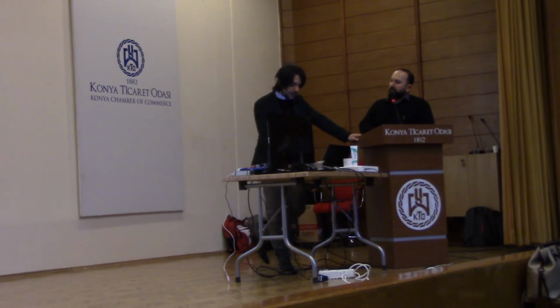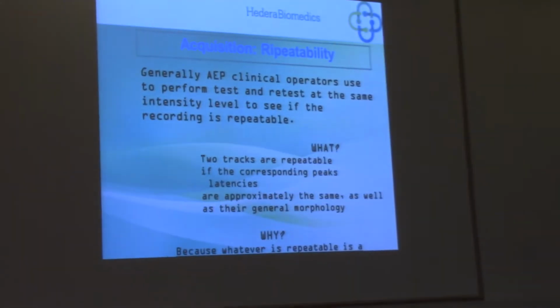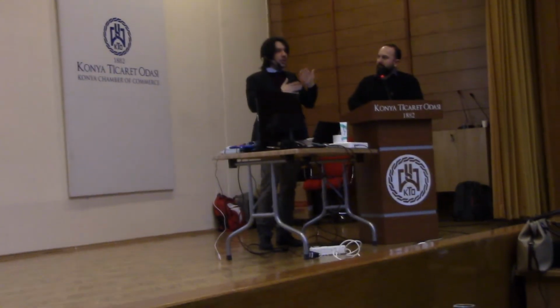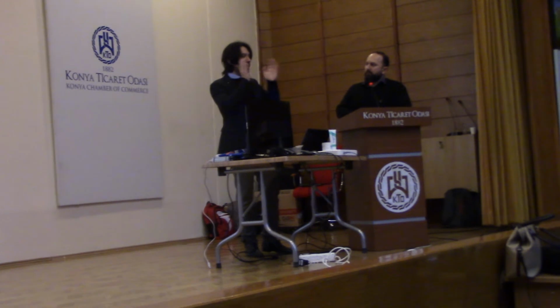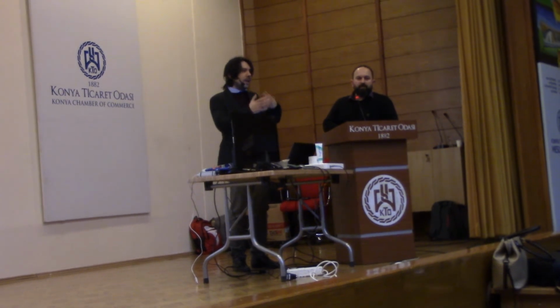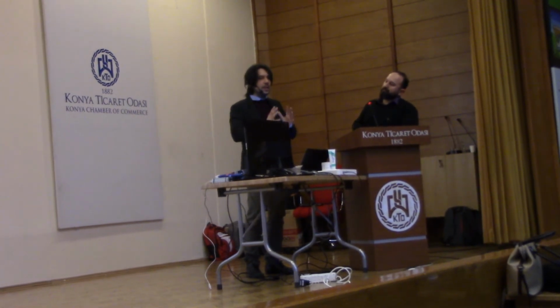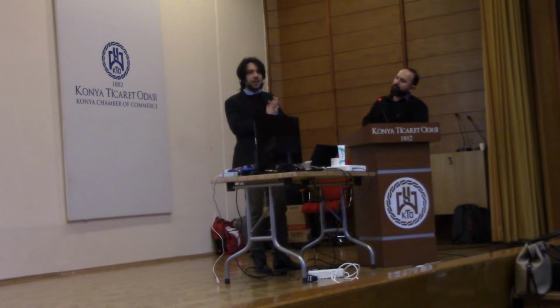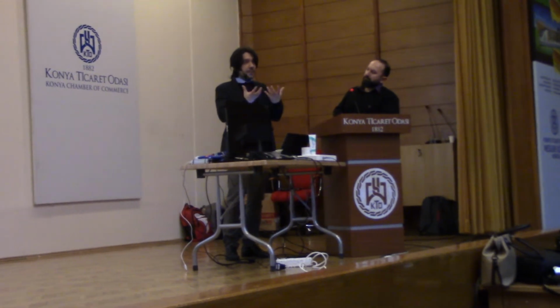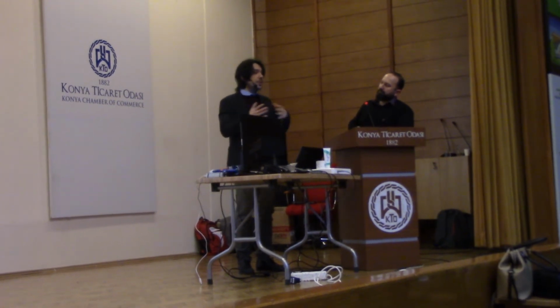What is the averaging? The averaging is the fact that you have a small signal, you have to improve the signal with respect to the noise, okay, the signal to noise ratio, and to improve it, you do an average of all these pictures of your EEG synchronized with each stimulus, and you extract the response, because whatever is repeated will be encouraged in the final response, and whatever is random will be less evident little by little once the sums are starting to be 300, 400, 500.